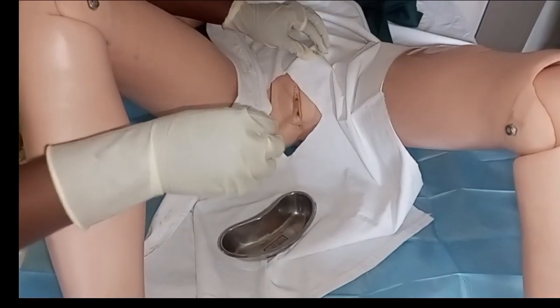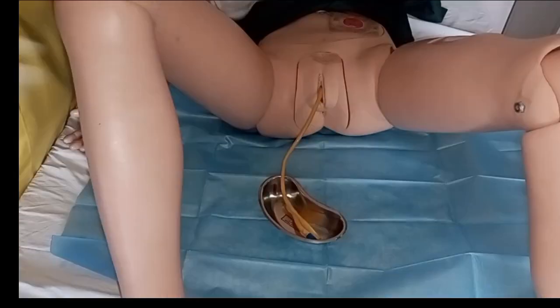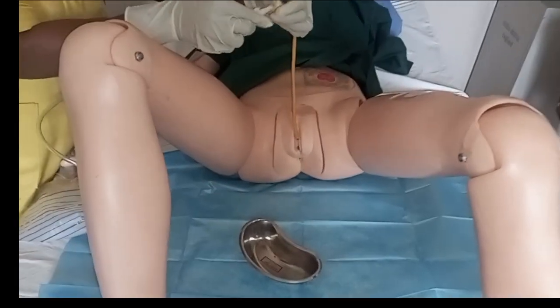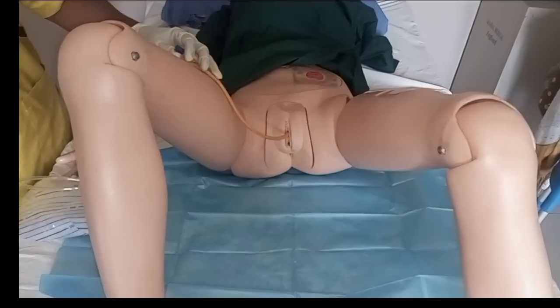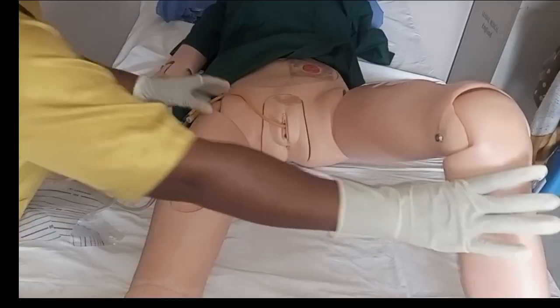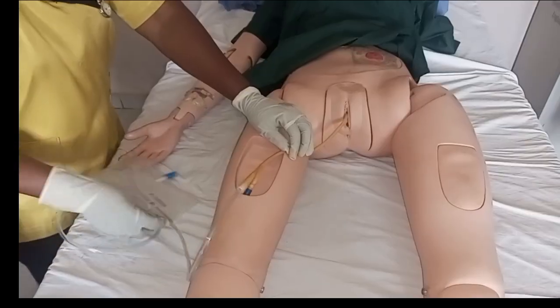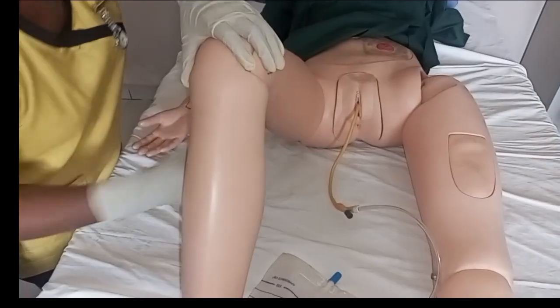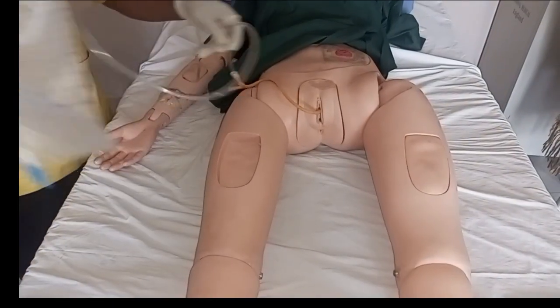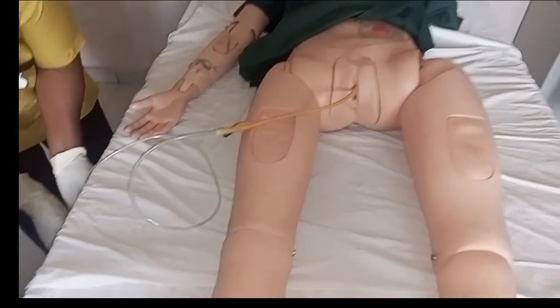Try to pull back gently to make sure that the catheter is in place and the balloon is well inflated. We are done with the procedure. Collect the urine bag and connect it back to the catheter, then discard the used equipment. Secure the catheter to the patient's thigh using plaster. Please note: do not allow the catheter to go under the patient's thigh — always allow the catheter to rest on the patient's thigh — and make sure the urine bag is below the patient's level so it can drain well.